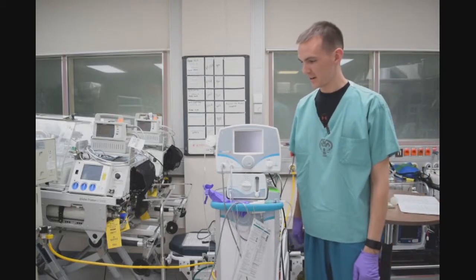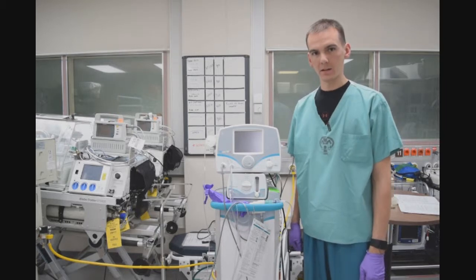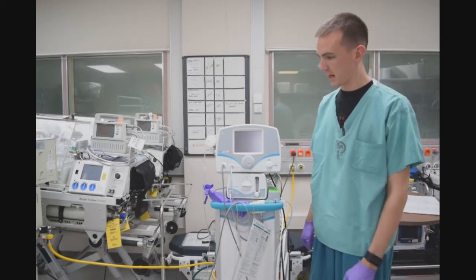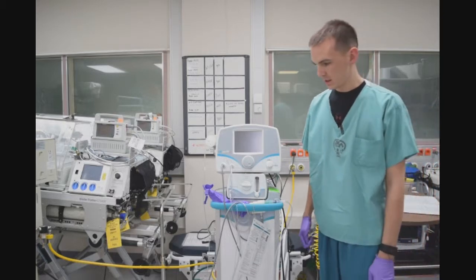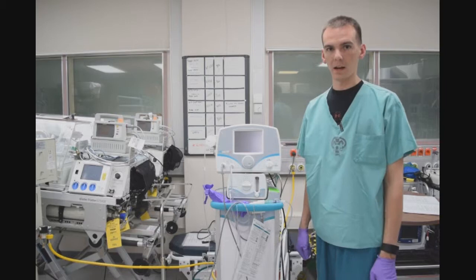Hi, my name is Sergeant Dixon. I'm a respiratory therapist at Longstor Regional Medical Center. In this video, we will go over the proper calibration of the INLMAX DSIR. This is for training purposes only, and I am not a representative of INLMAX.